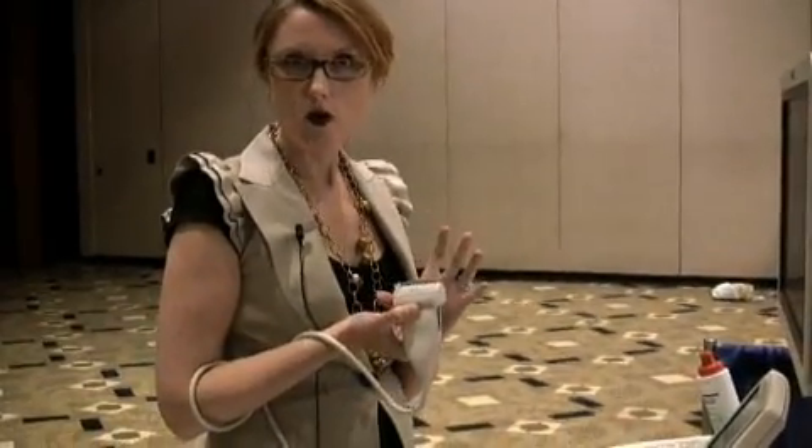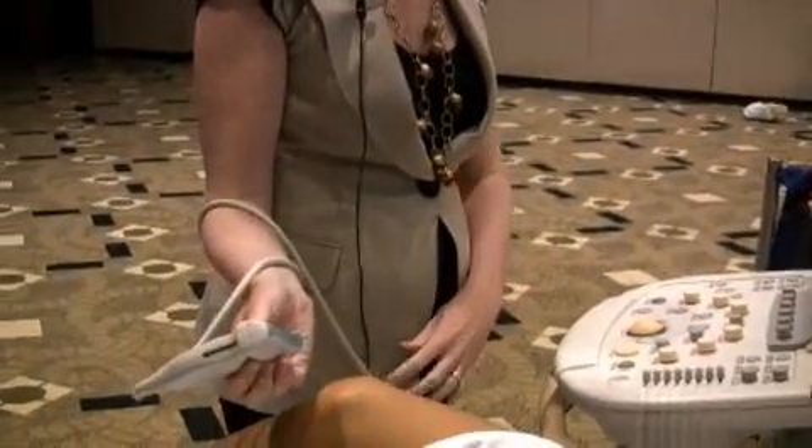We're going to do a basic knee demonstration using the Philips IU22 system. I have a linear 12 transducer which is the best for knee examinations.